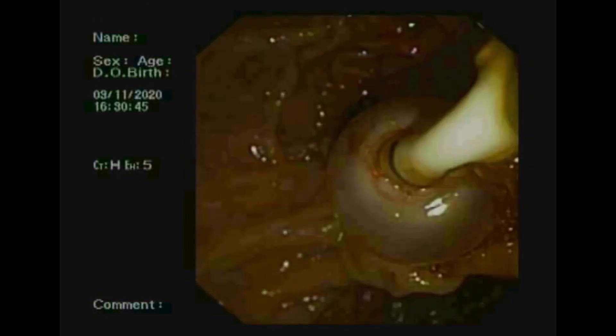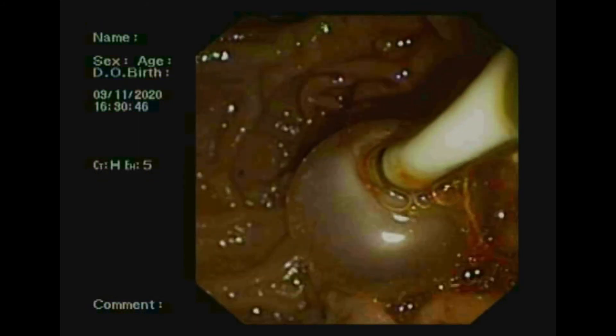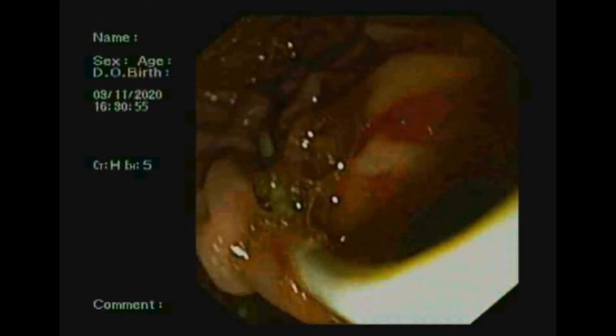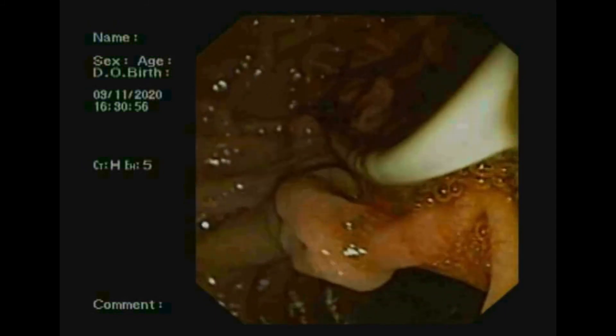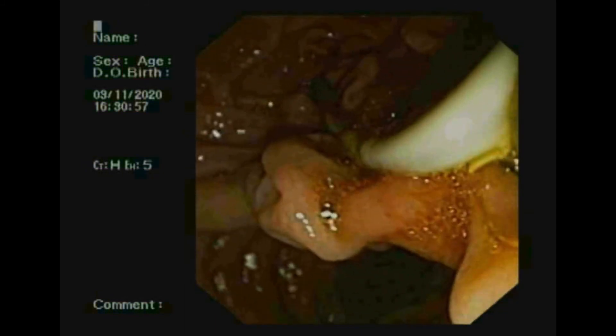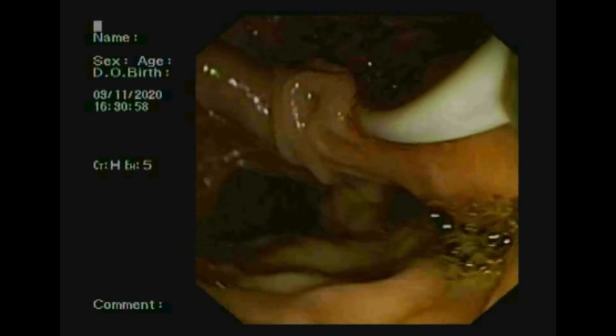After clearance of all CBD stones, we performed a check cholangiogram to look for any filling defect in the CBD. The check cholangiogram was clear. The patient was discharged the next morning.